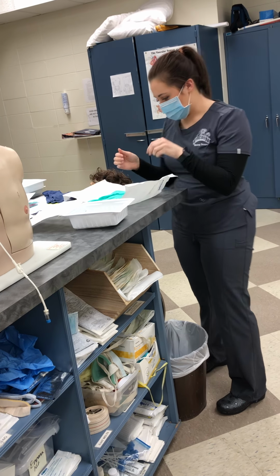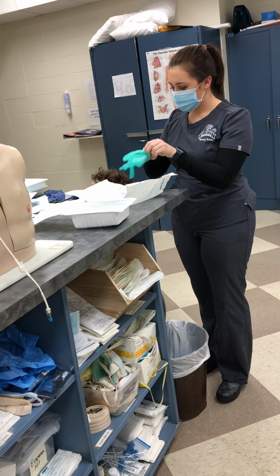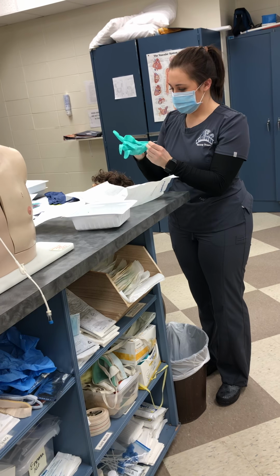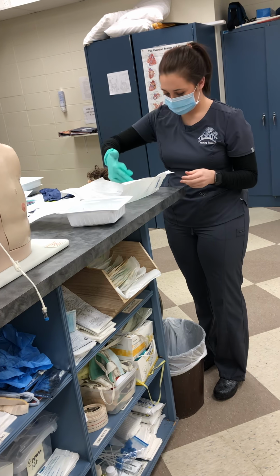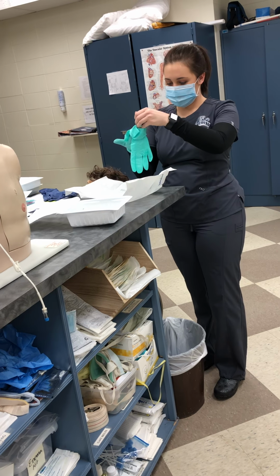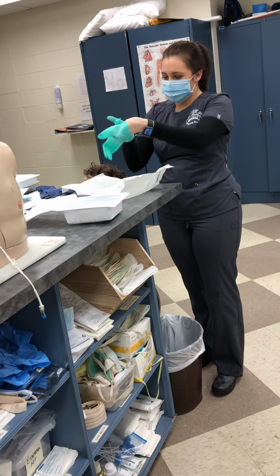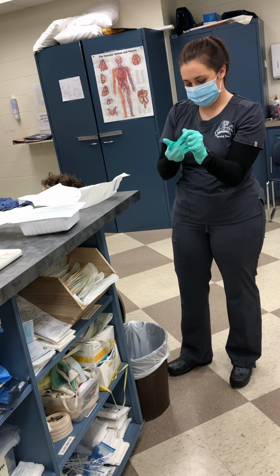I'm going to put these on. I'm going to fix this hand.